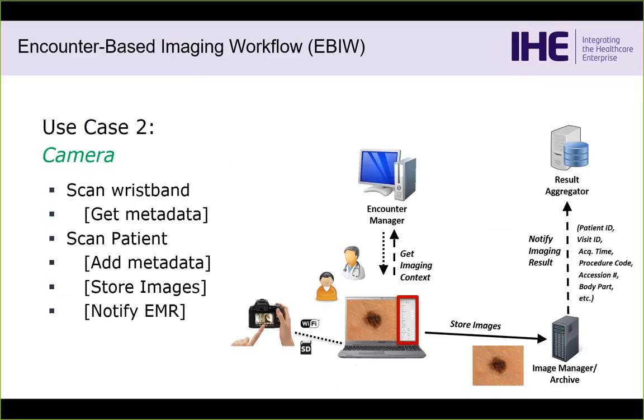One more abracadabra, so watch carefully the tablet, and same thing would work if you're using something like an SLR. If you imagine in the CT suite, people think of the gantry as the modality. In DICOM terms, it's actually the operator console that's the modality. When we make a CT gantry, it's using completely proprietary protocols to talk to the console, but it's the console that interfaces to the rest of the organization.